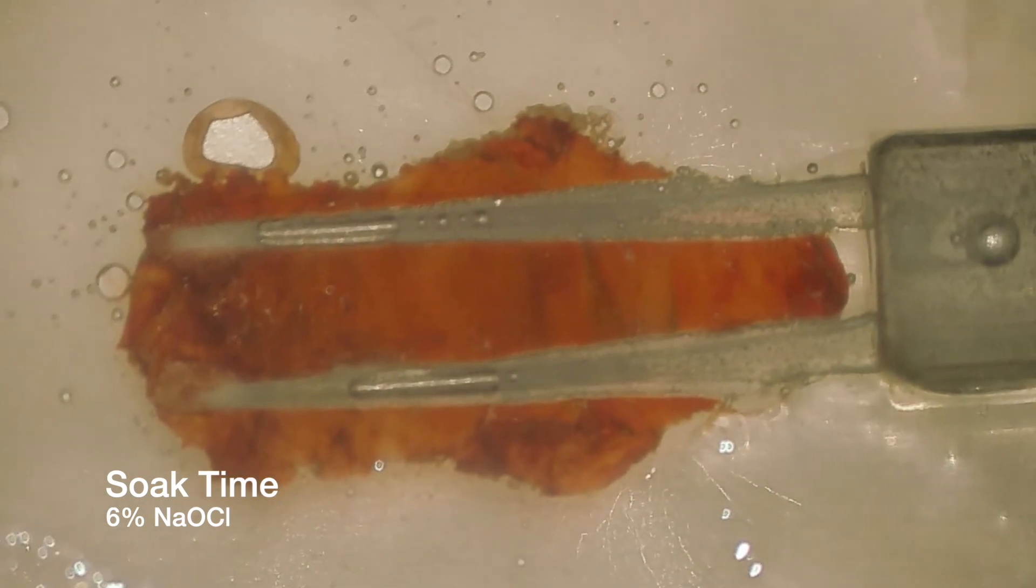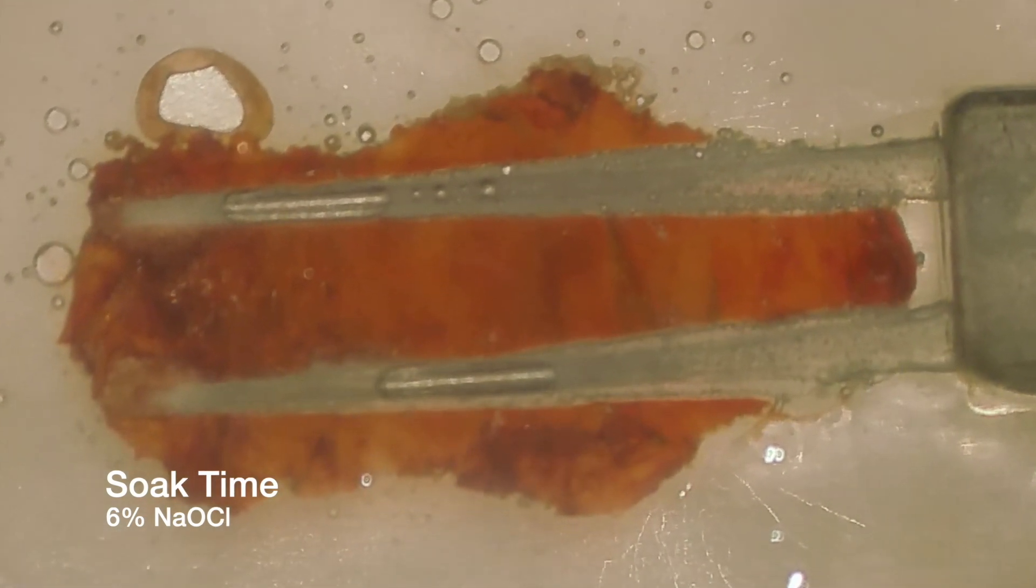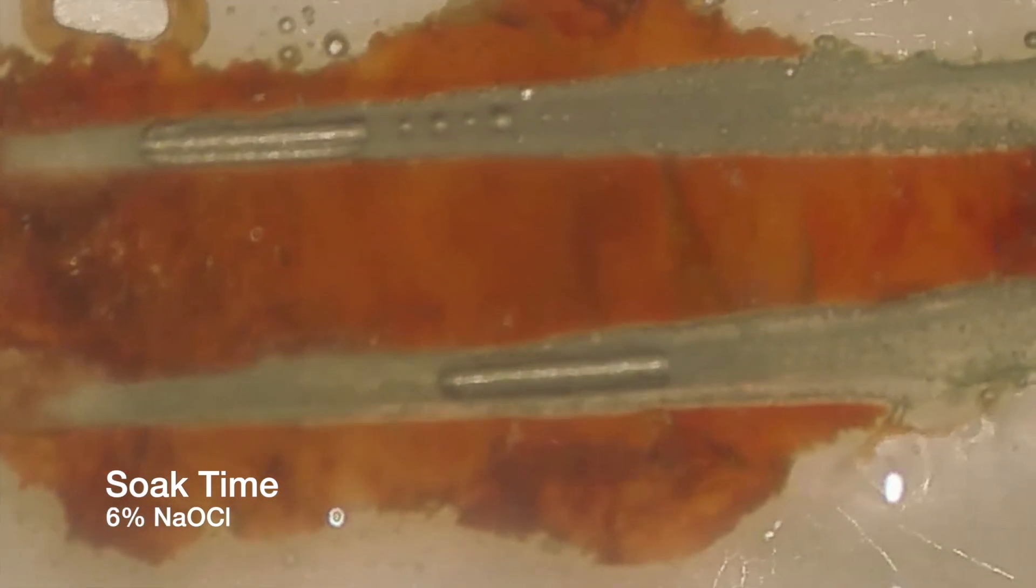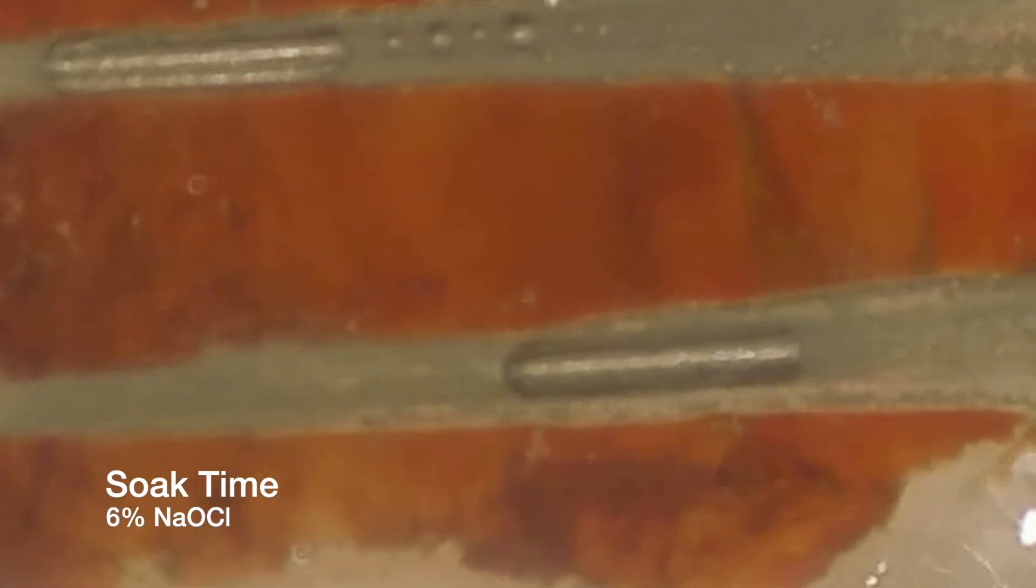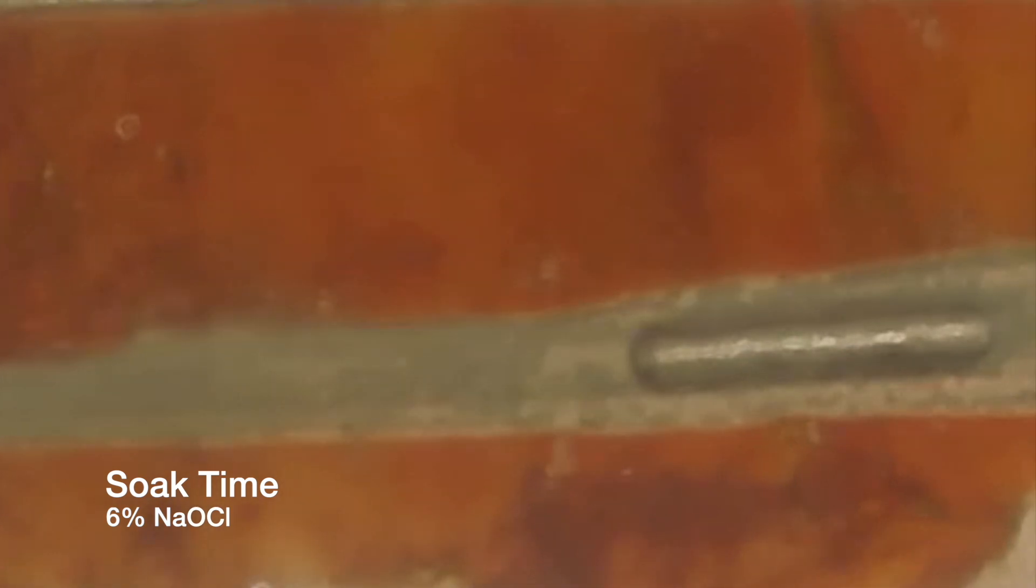But there is tissue being hydrolyzed as we watch. Notice there is an air bubble, which is actually moving coronally and is placing solution around it. So apparently not all vapor locks are equal.